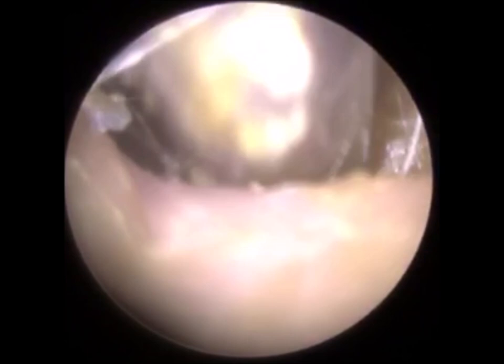So forceps weren't really cutting the mustard there. It was just shredding it and actually pushing it back in. So I've just gone back in with the suction probe, just trying to bring it to the entrance of the ear. And again, it's a combo of instruments we're using. So bringing it to the entrance, and I think I might go back in with the forceps. Once it's at the entrance, I can grip it and pull it.